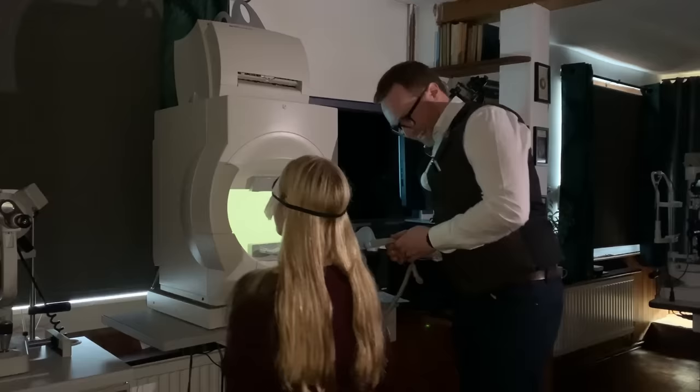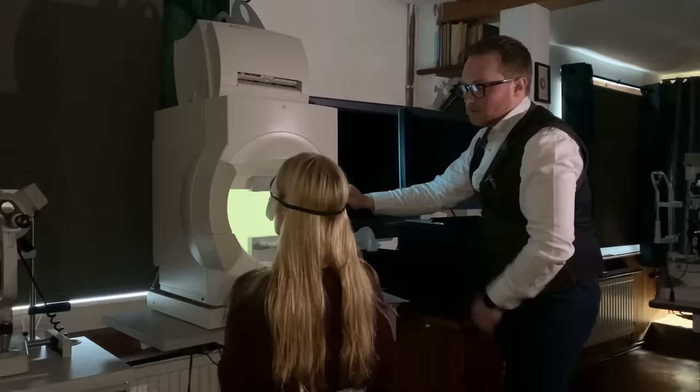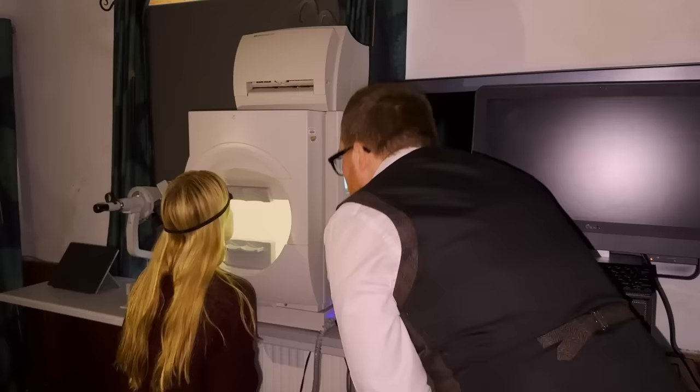I'm going to give you the clicker. It's just that bit at the top, a bit like an old-style computer mouse. Now, with this one, you'll be popping your head to one side. You see that there's two parts of the chin rest, so it feels like you're off centre. It's perfectly normal. So I'll get you to pop your chin on the left-hand side, and put your forehead against the bar at the top there. Is that comfortable? Yeah. I'm going to bring the chin rest down a little bit.